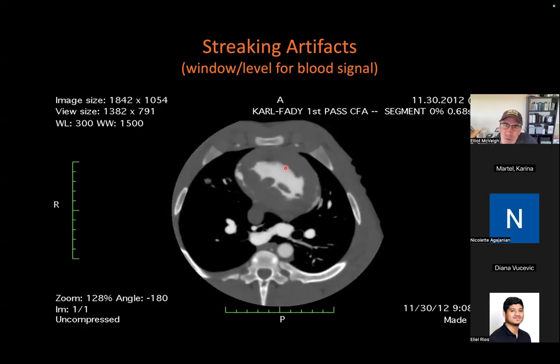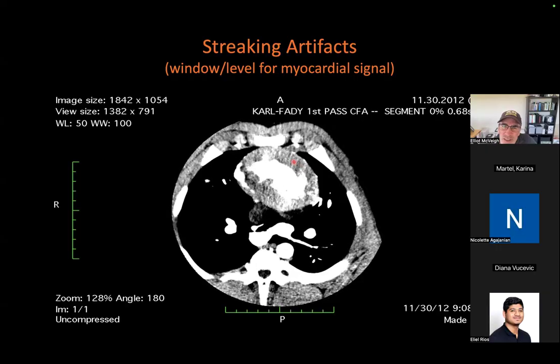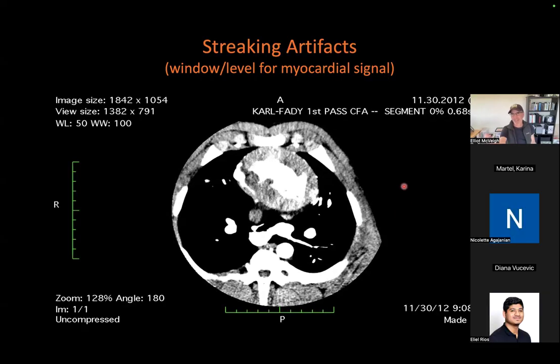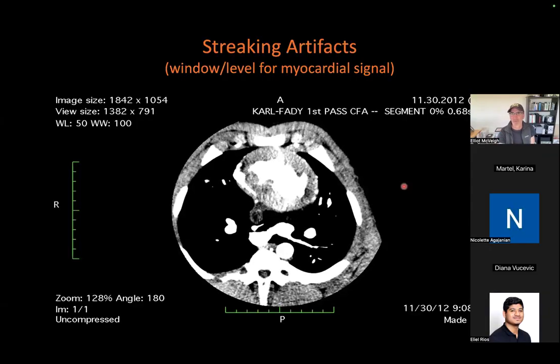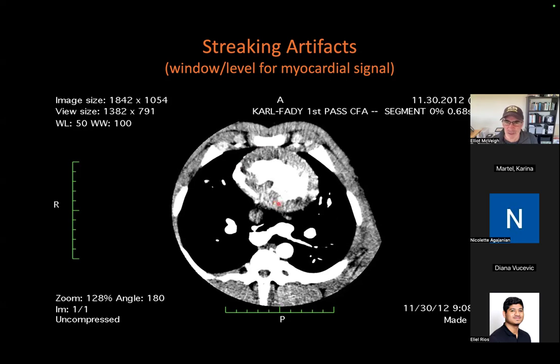And we can see that the signal to noise of this data is quite high. We have beautiful delineation of the myocardial boundaries and the LV function. But when we look at the consistency of the signal in this myocardium by doing that same trick and focusing our brightness on the myocardium, you can see there is a very systematic distortion of the signal in the myocardium, right? And that systematic distortion seems to be rotating around the heart, right?